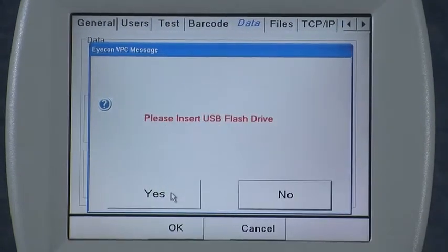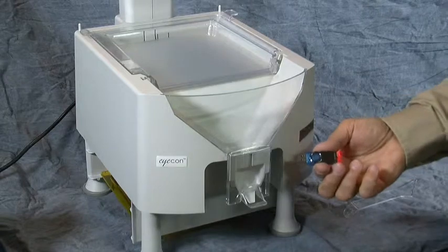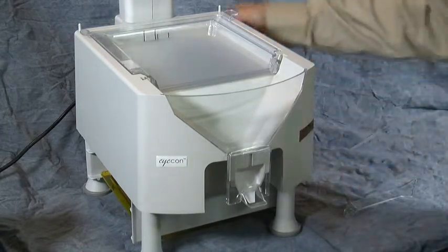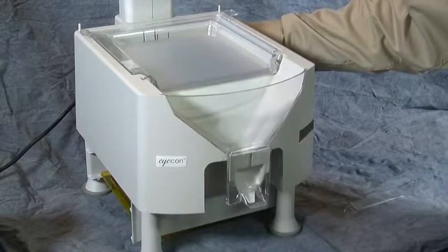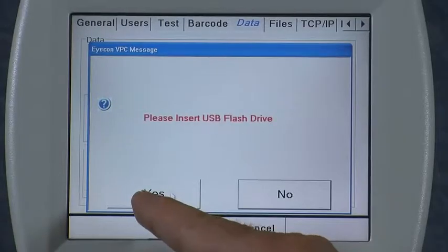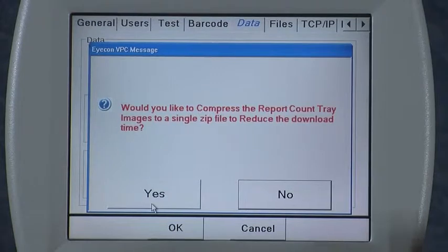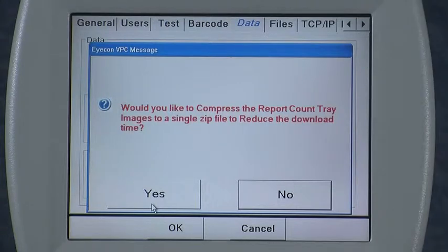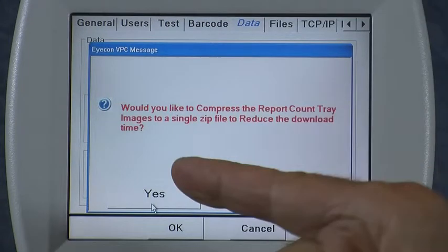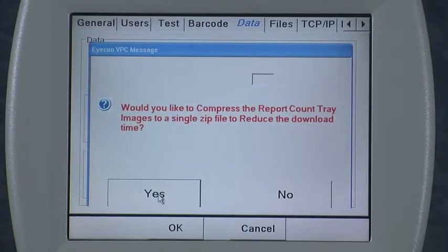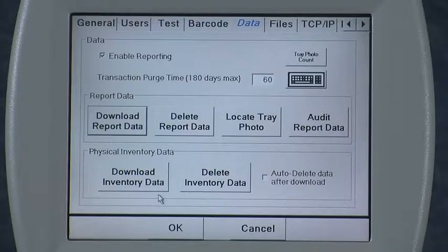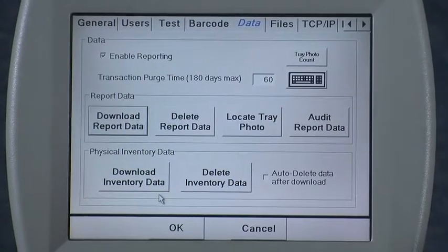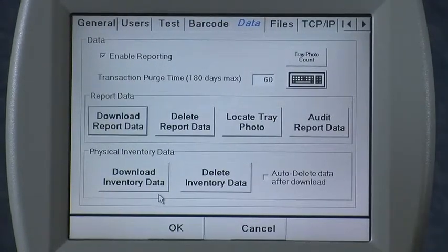If you press yes, it's going to ask you to insert a USB memory stick. Take your USB memory stick and simply insert it into the back of the icon — there are two ports on the back and either one is usable for this. Simply insert the stick, wait a second, and then press yes. You're then prompted whether you'd like to compress the report count tray images into a single zip file in order to reduce the download time. I would normally say yes, and it will zip up all those files and save them. There are only a small number of photos here so it happened very quickly. Then go ahead and remove the memory stick once the indication is given that the download has been completed.